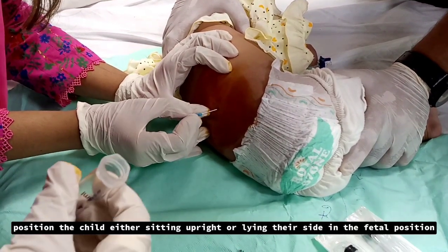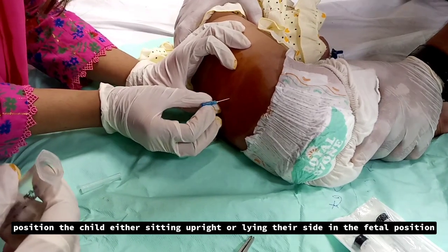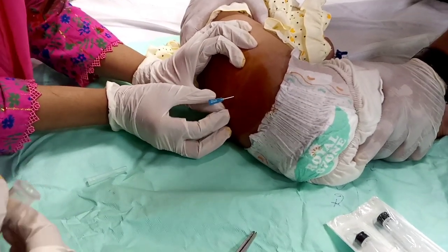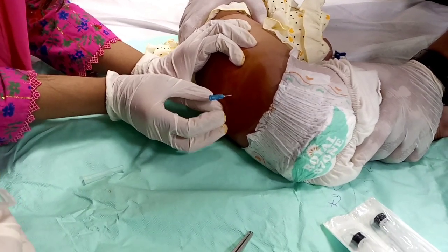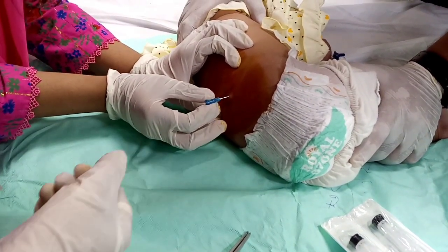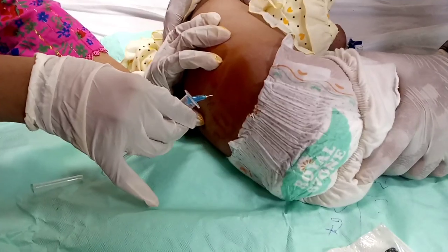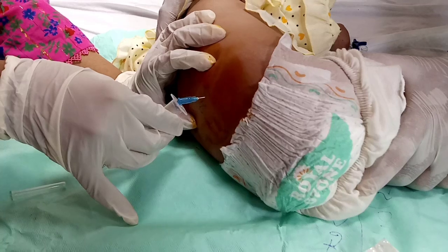For patient positioning, palpate the spinous process to identify the L3-L4 or L4-L5 interspace for the insertion site. Using a spinal needle, insert into the chosen intervertebral space, directing it slightly upward.